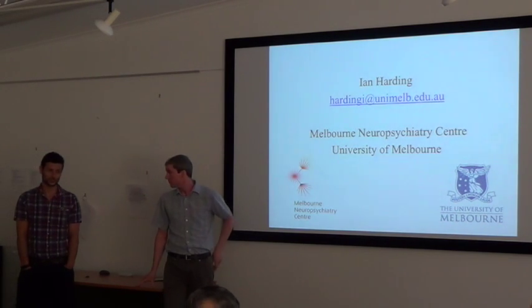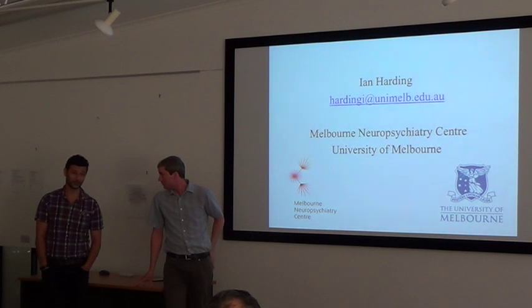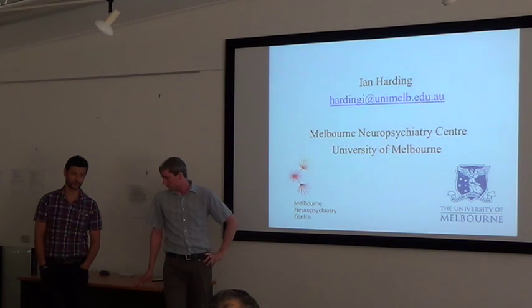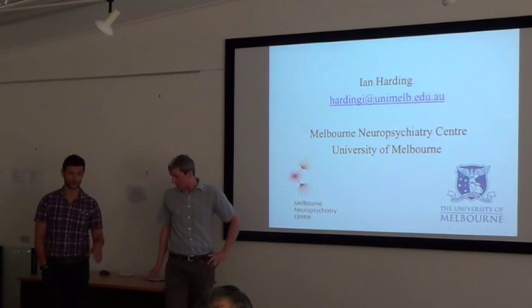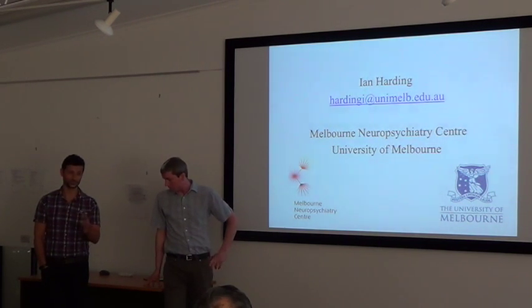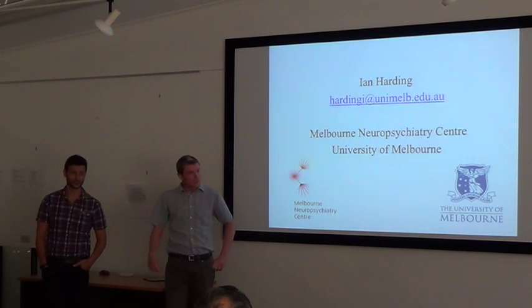We have tasks at the moment that do go up to half an hour. Sometimes when you're doing learning paradigms, it takes a while to learn things, and you just got to be very careful the way you design them to not, like what Ian was saying, acquire a bunch of noise. It has to be designed in a way that you can actually do those long half an hour type studies. That's a good point too.